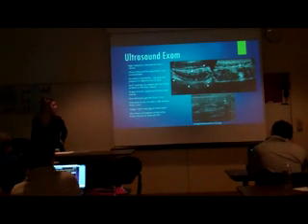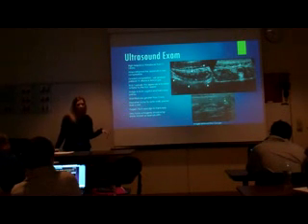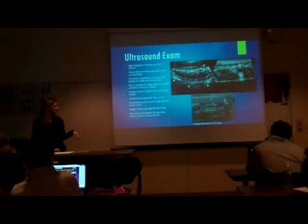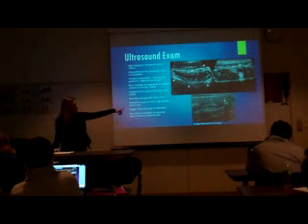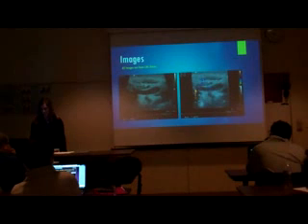The wall thickness should not measure greater than 2 millimeters, and the diameter, outer to outer wall, shouldn't measure larger than 6 millimeters. In transverse, as you can see in the far image over there, is a target sign or bullseye sign, and then the appendicolith is the echogenic area with the shadowing, which is the stone, and is often present.